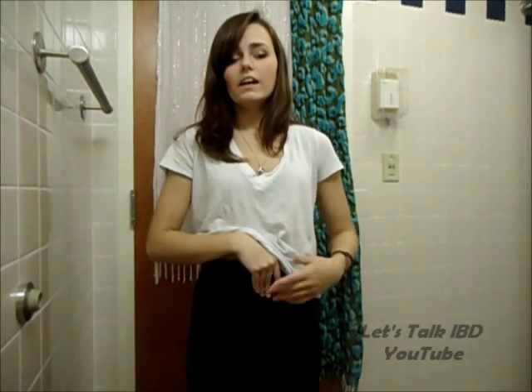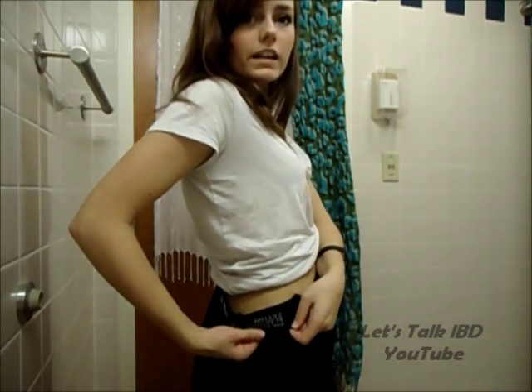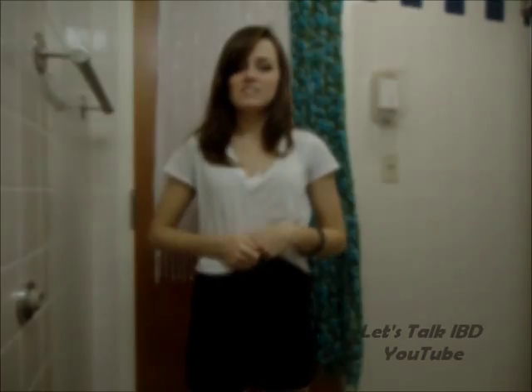It also offers hernia relief. Another cool thing about all the Comfiz products is that they don't have the irritating label inside. Do you see that writing right there? That's your label. There's no little tag digging into your side, which is so annoying — but they don't have them.